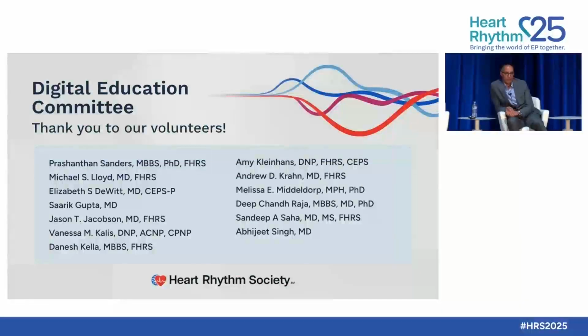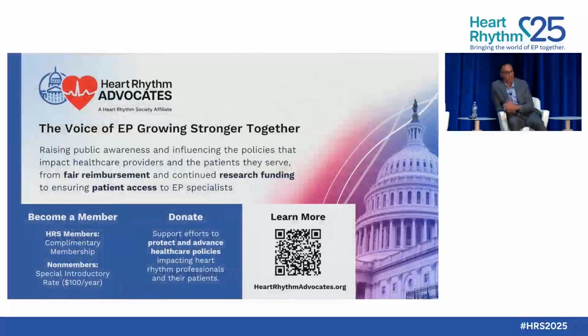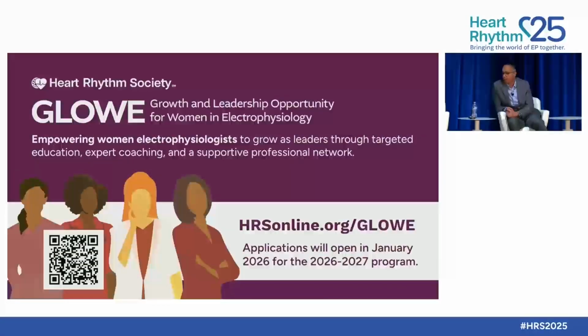And so I think that with tailored, like in anything, the question earlier about interpretation, it is our job, based on what Volta tells us, to still decide an ablation strategy, right? You can see dispersion in the right atrium and the left atrium, but what are you going to connect it to? What are you going to do? And that's our job, as an electrophysiologist, to make sure that we understand whether we're actually making the patient pro-arrhythmic versus not. I think we all know, and it's the reason many of us don't do more ablation beyond pulmonary veins or even the posterior wall, that it can be pro-arrhythmic if not done properly.